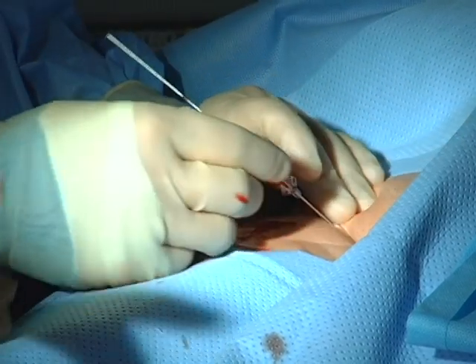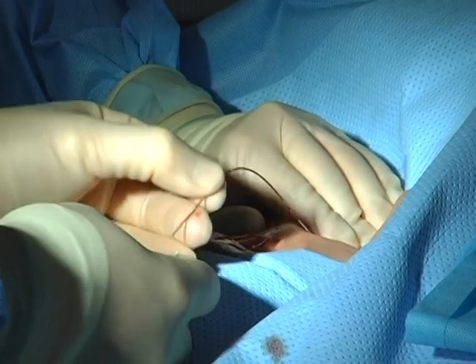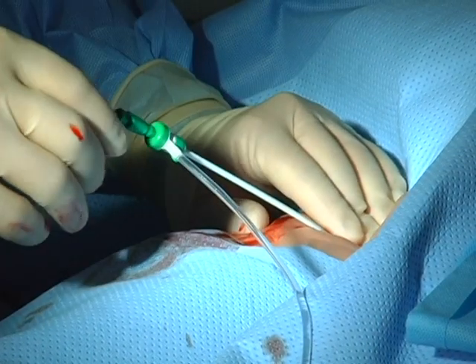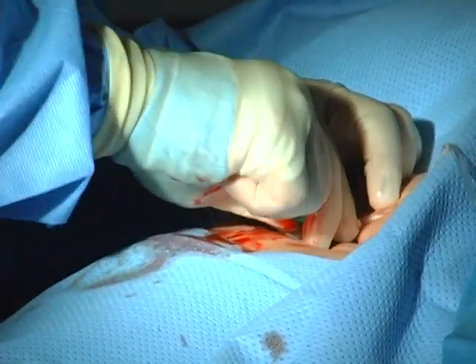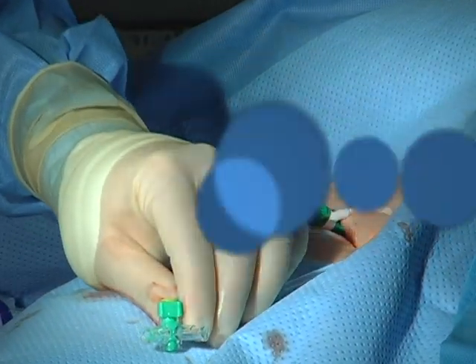Okay, he is going to press with the last 3 fingers and pinch with the first 2 of the left hand. Pull the needle off. His assistant or himself, he could introduce the sheath over the guide wire, and then with a rotary motion, he's going to introduce the sheath into the vessel. Okay, it's important to make sure that when you're done, you flush the sheath and take the sharps off the field. So that's what we're doing.